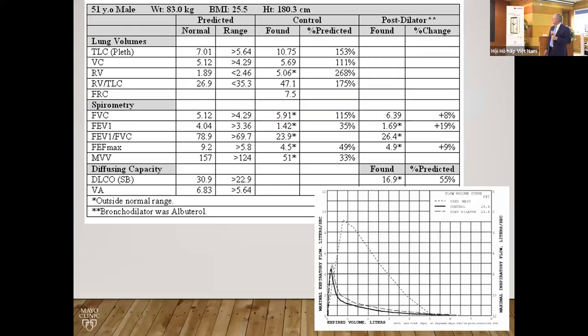Rồi mình tới với ca này, chắc đây là ca cuối cùng. Thì mình thấy đầu tiên là coi cái đường cong mà chắc chúng ta cũng quen rồi ha. Nhìn cái đường cong này là mình biết. Đây là đường cong lưu lượng thể tích của một người bị tắc nghẽn, mà chắc cũng tắc nghẽn vừa nặng trở lên.